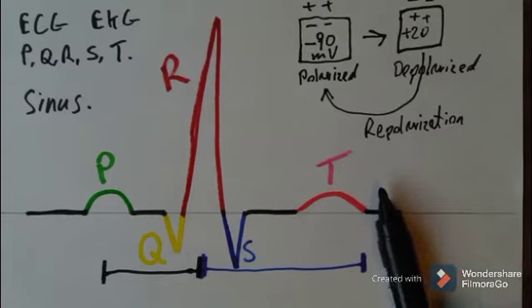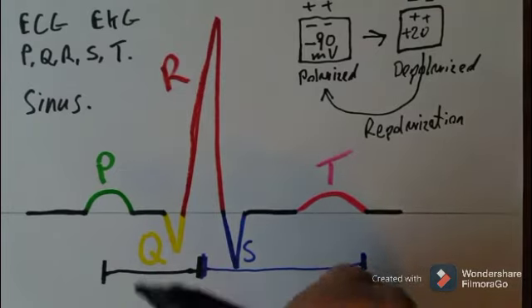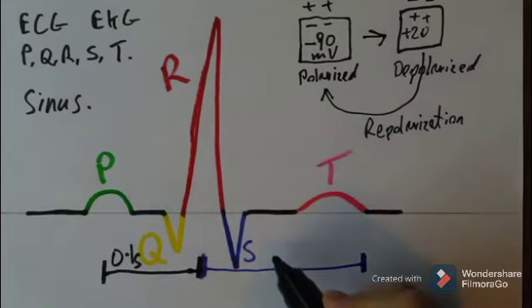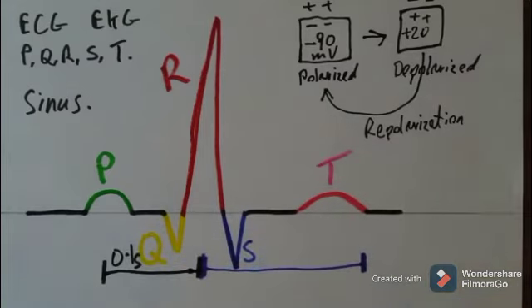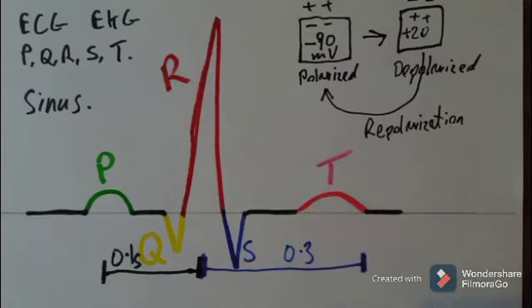And this is what we've drawn actually here is a cardiac cycle. So the atrial systole takes about 0.1 of a second, and the ventricular systole takes about 0.3 of a second. If we assume the whole cardiac cycle is about 0.8 of a second, as it would be if the heart rate was around about 74 beats per minute, which would be fairly normal.